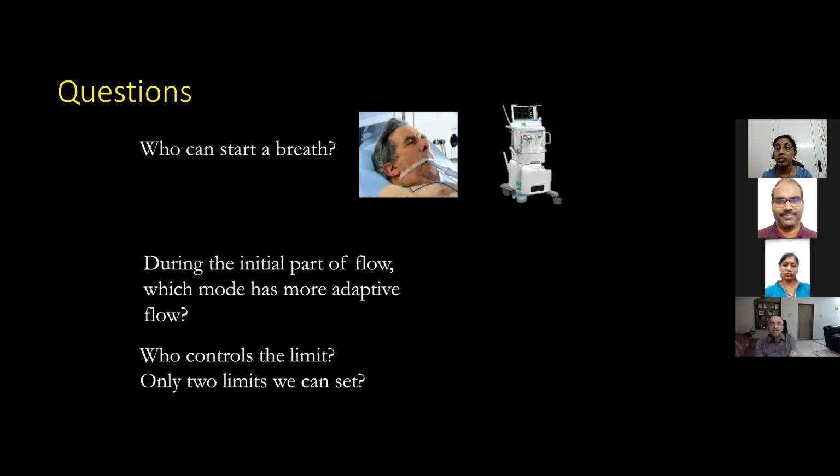Okay. During the initial part of the flow, which mode is more adaptive? Which mode has more adaptive flow? Either volume control or pressure control. Sir, if the patient is passive, then... No, I have said that. I have to ask you a question. During the initial part of the flow, which modes have a better flow that is adaptive to the patient? Pressure limited modes.